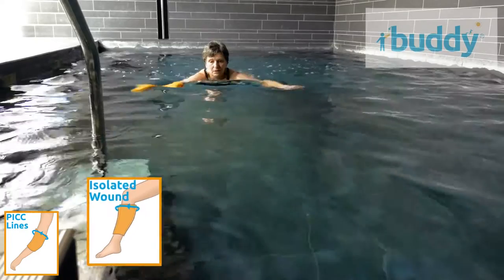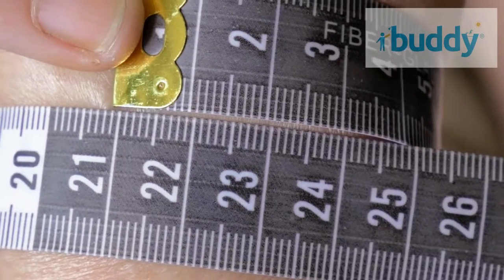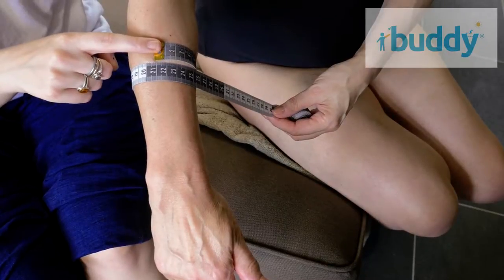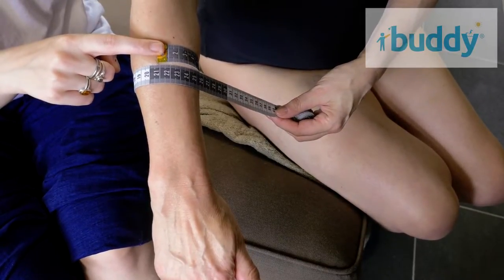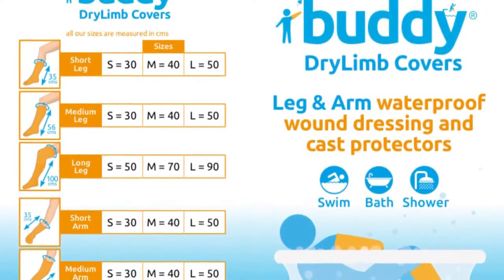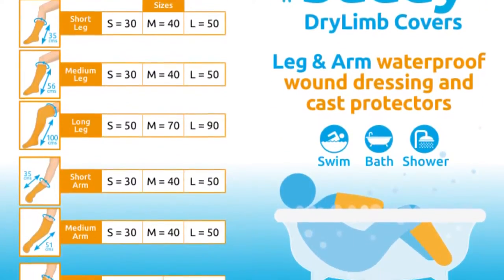To order your Buddy cover, first measure in centimetres around the fleshy part of your limb, approximately four centimetres above or below the cast or dressing. Then check the size guide on our website, rounding up to the nearest size to ensure the correct fit for you.